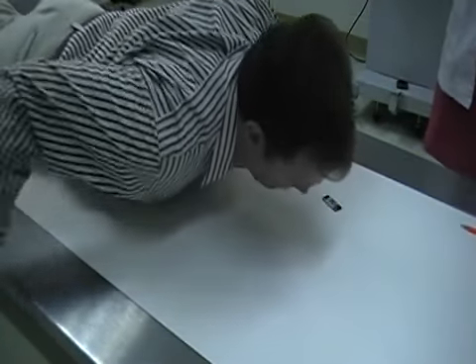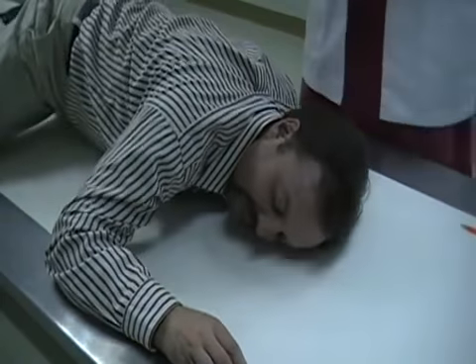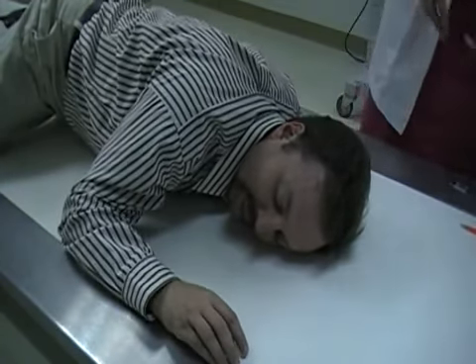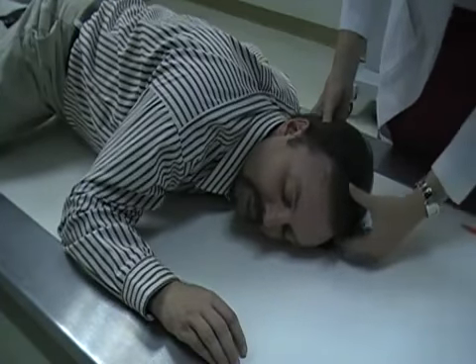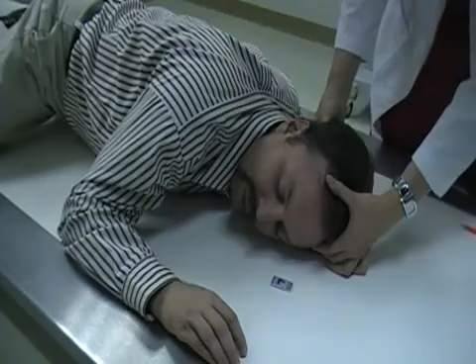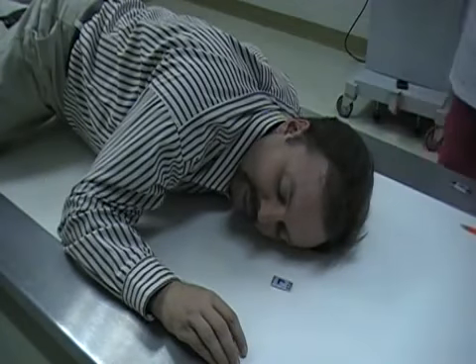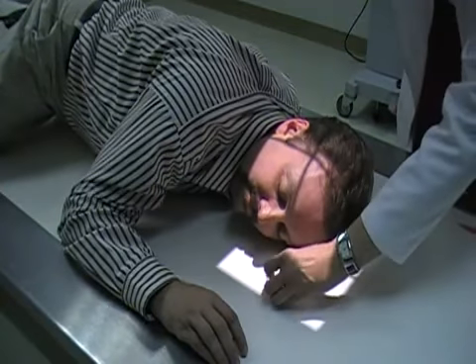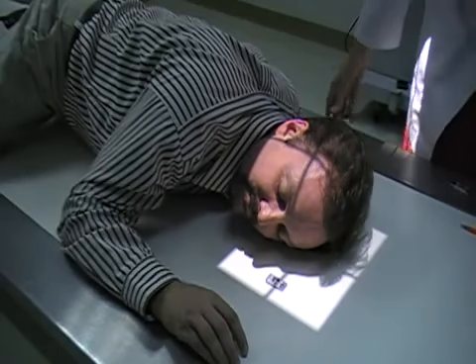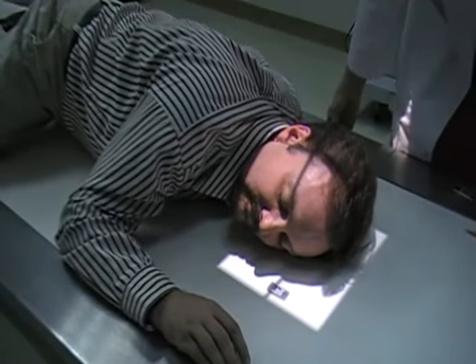Now I'm going to do the left lateral. So David is reversing his arms, left arm down by the side. Head is turned so that the left side of the face is down. And I've put my left marker out in front here. Our central ray is going to be 2 inches above that EAM.